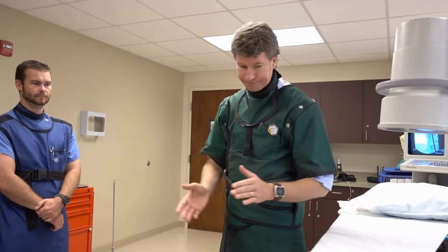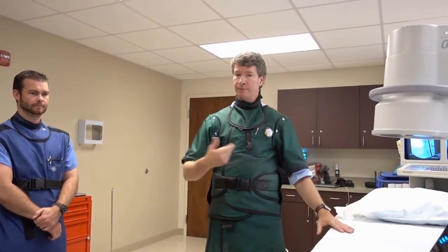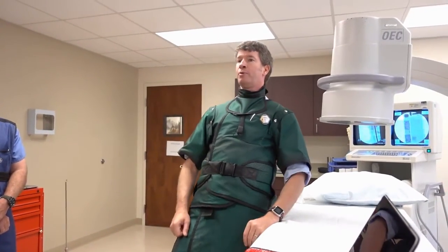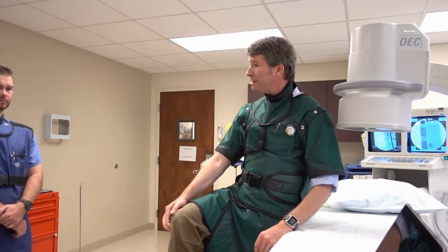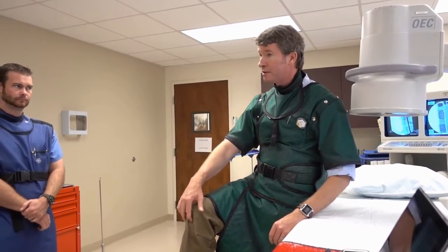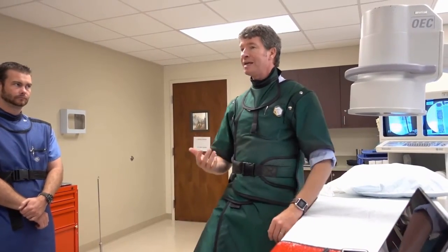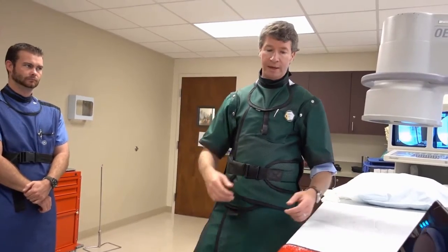So, being in the room, what we do is we put the patient in the supine position, and that way they can lie on their back and have a bent knee projection. It's easiest for us to do bent knee. We can either go on the outside or on the inside, on either side of what's called the patellar tendon. We can do the exact same easy, painless injection when they're lying on their back with their knee bent.